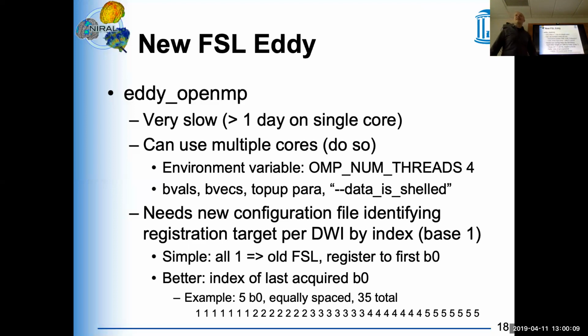That's why I'm saying one is better, the other one is simpler, because that makes it non-simple. Now you actually have to have a program that generates this, or you have to do it manually each time, and if you do it manually each time, you may quickly introduce an error, so I do not suggest you do this manually each time. If it's not something that comes with a tool, and currently there is no tool for it, I suggest you do not do upfront removal of DWIs, but later on.